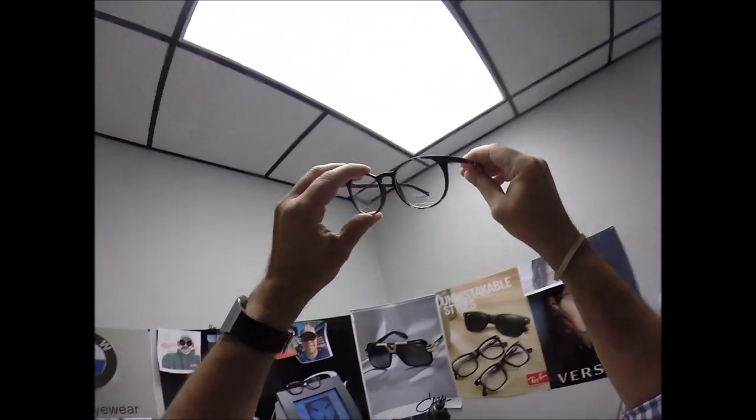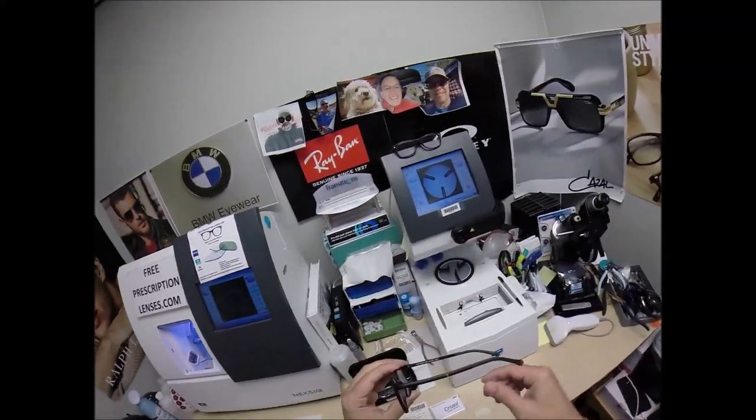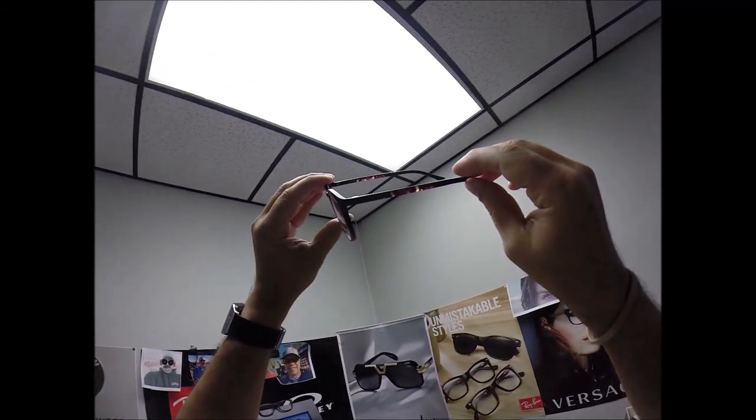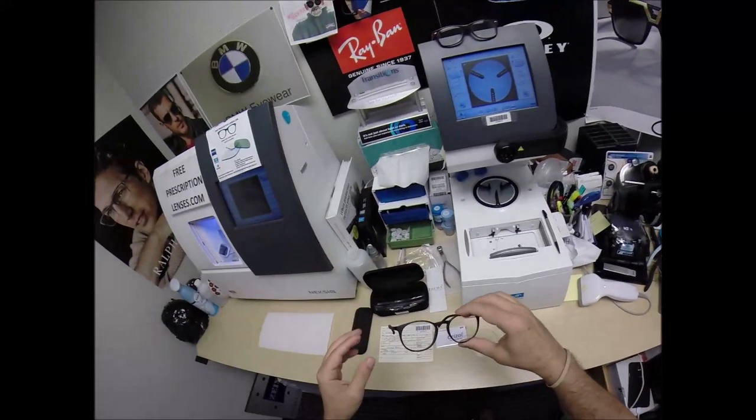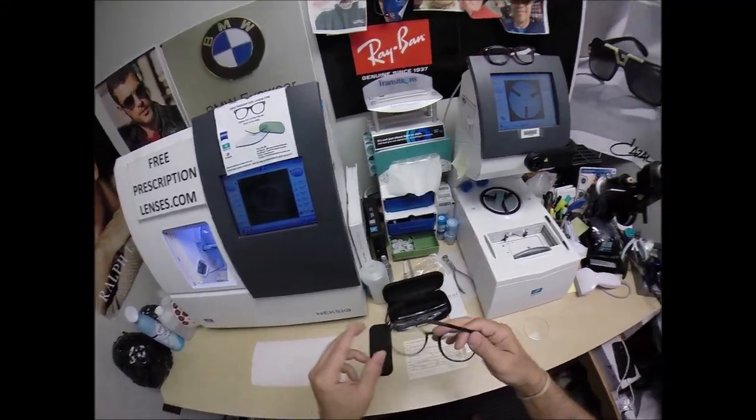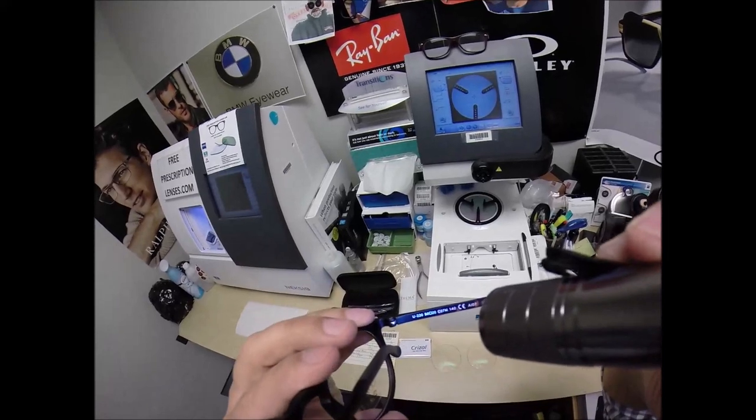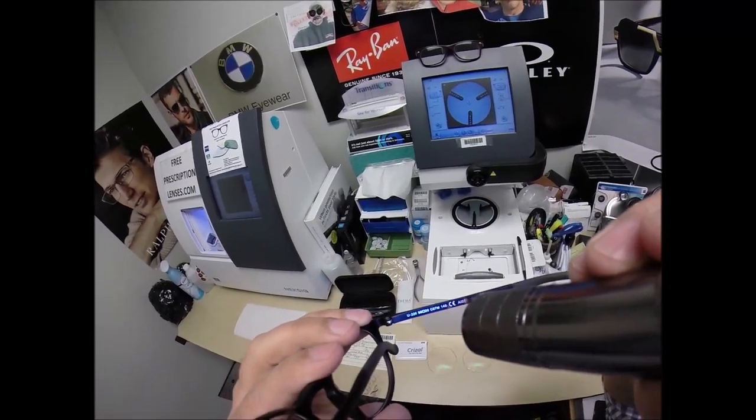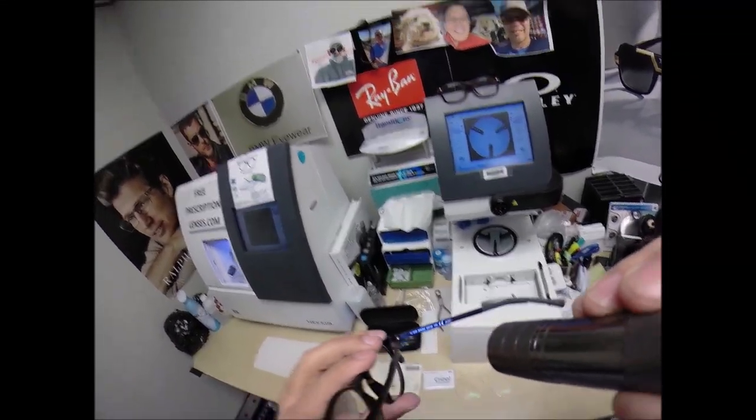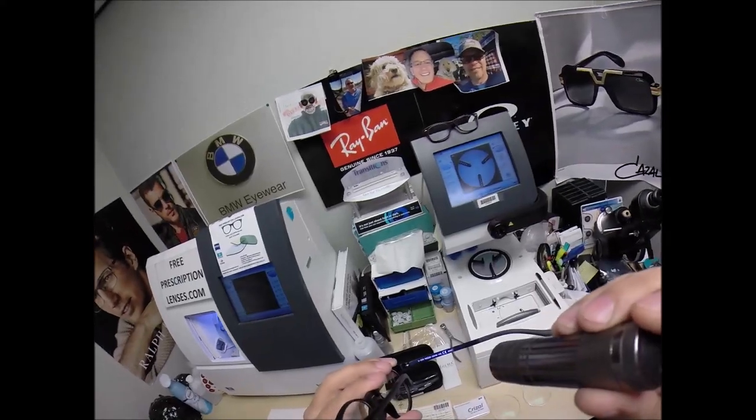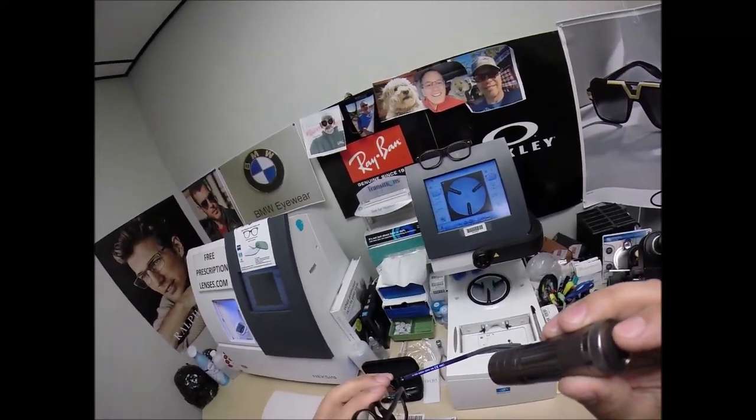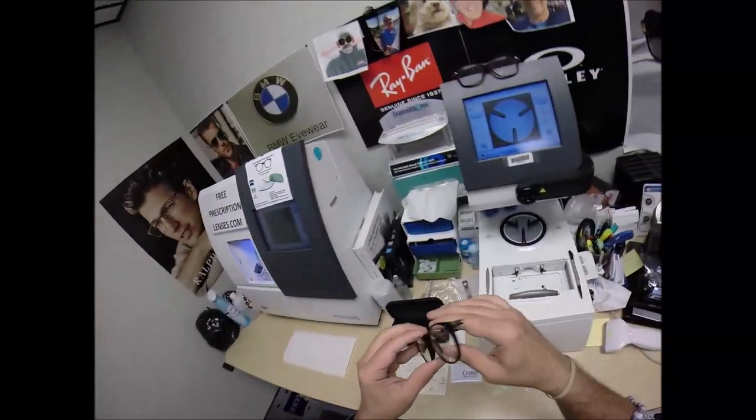But this is the Ultem 220 color 7. This is a tortoise color. That's why I was holding it up to the light so you could see the tortoise aspects of it. I don't know if my camera is good enough to pick that up. But this is the Ultem 220 size 50 with a 20 bridge color 07, which is the 7M, which is the tortoise. There's also a color 2, and it's a 140 temple length.